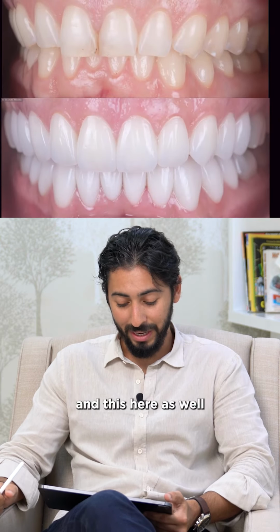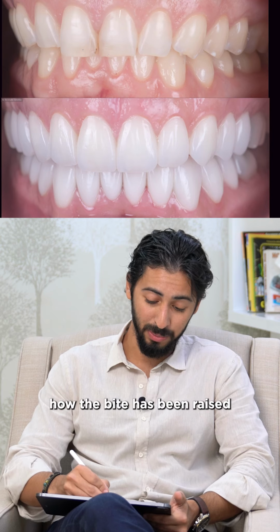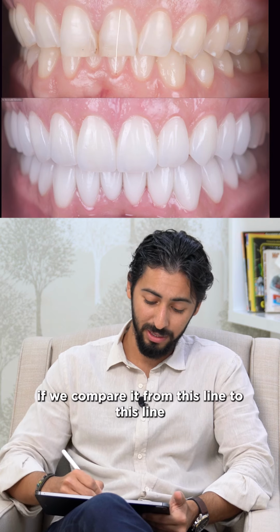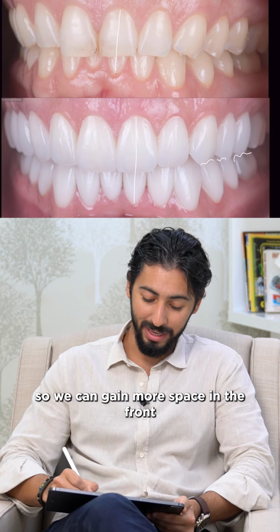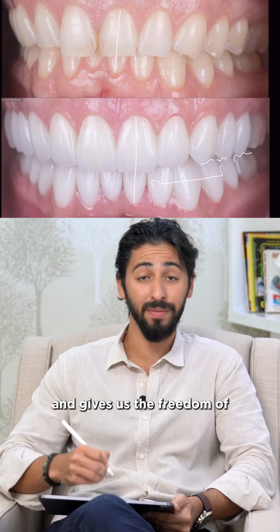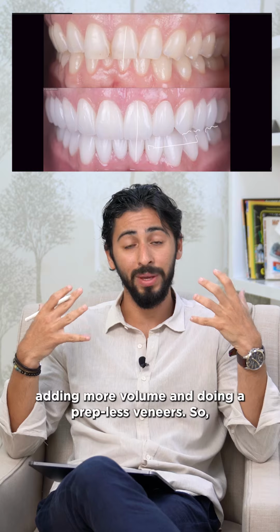And here, as well as in the intraoral picture, we can see very clearly how the bite has been raised if we compare from this line to this line and from this line to this line, by adding more porcelain material on the top, on the back, so we can gain more space in the front and gives us the freedom of adding more volume and doing a Prepless veneer.